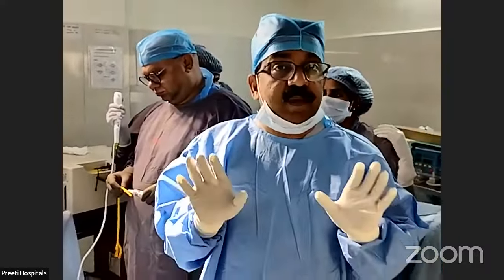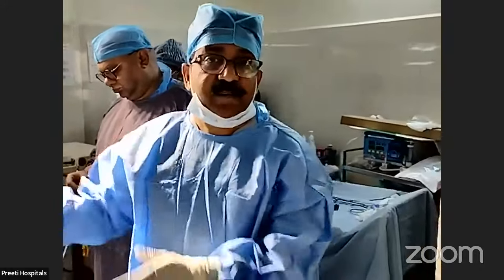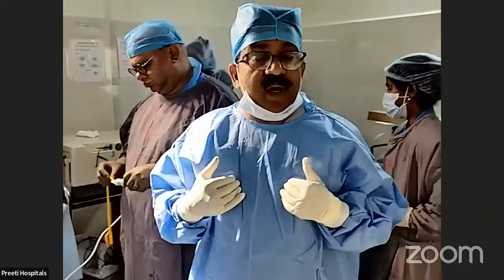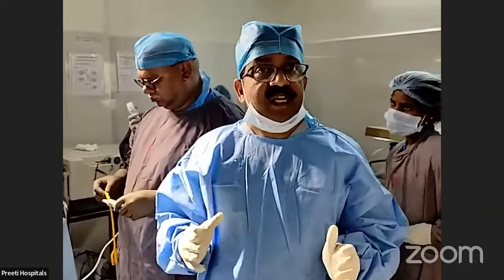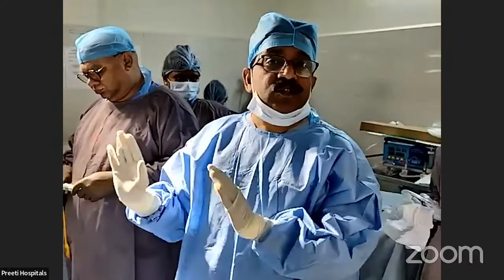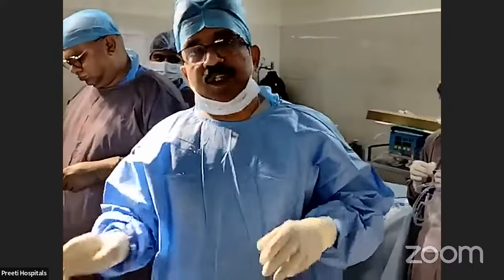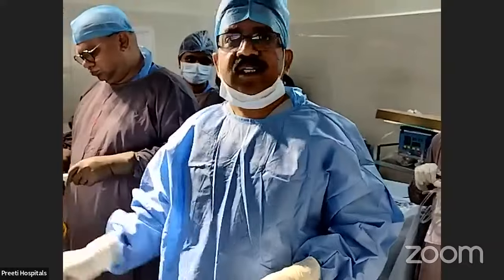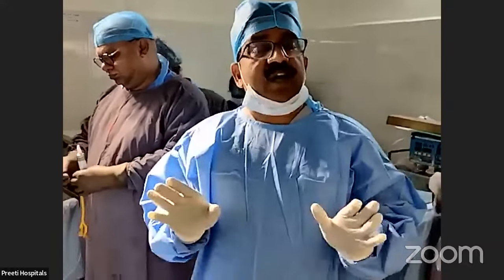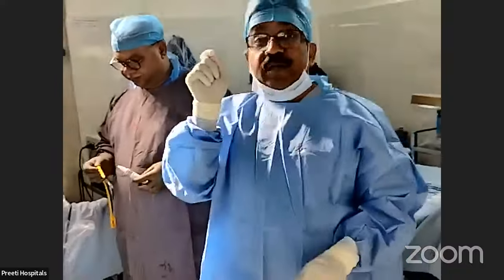At the end, complications can occur. This surgery should not be done immediately, first time, by a junior. Do 50 cases of normal small access sheath. We have done more than 10,000 cases over the last 12 or 15 years, and then attempted this slowly, cautiously. Today, I was really afraid that, live, I would not be able to pass the sheath. No problem. A normal sheath you pass, do powder, leave it. Up to this, we are doing that only. Nothing will happen. But at that time, the powder should be very, very small.